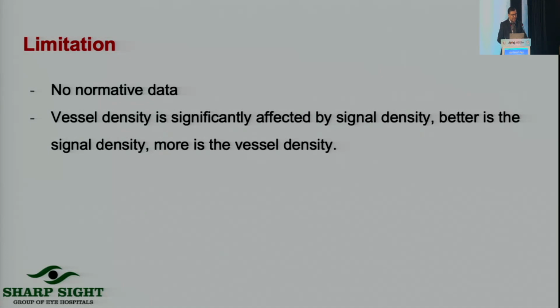Here also the limitation is that there is no normative data, and vessel density is significantly affected by the signal density. So the better the signal density, the better the vessel density.